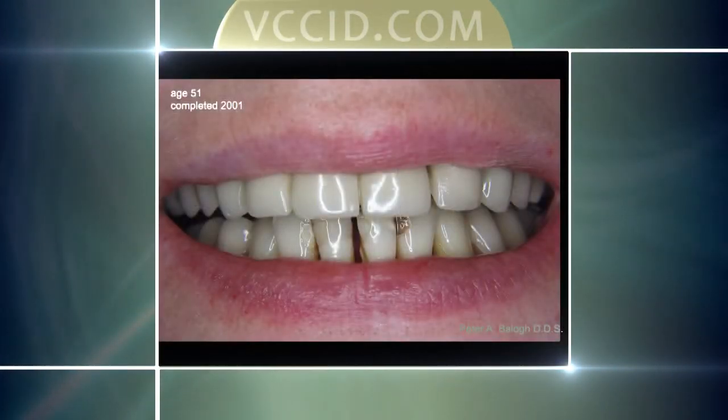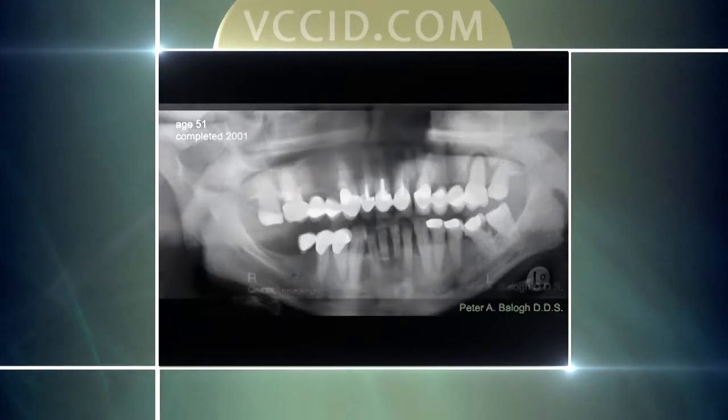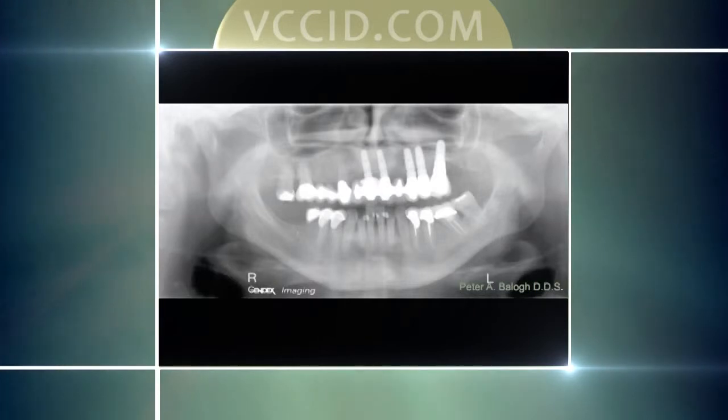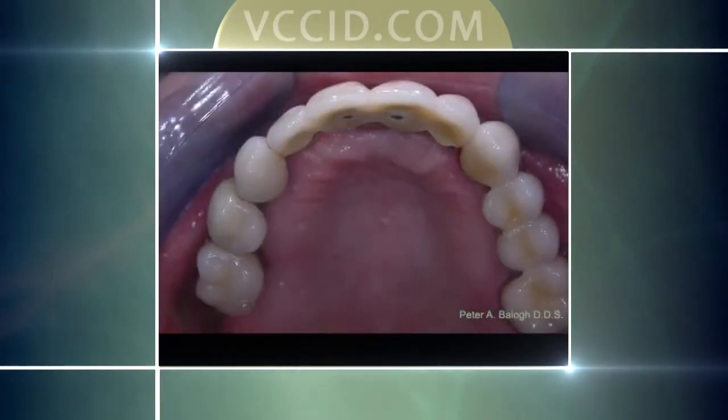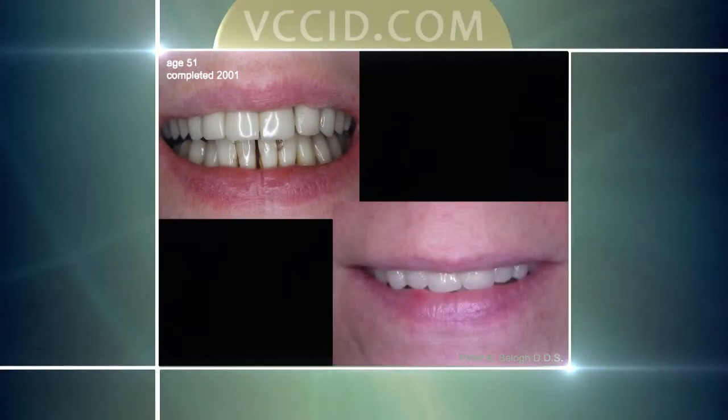Another situation done 13 years ago: there was an upper bridge with some teeth failing. The other teeth were salvageable and we could fix them. We had to replace seven teeth, and there are five implants holding that seven-tooth bridge in place. Here it is in the mouth and on the x-rays, and the before and after that you can see.